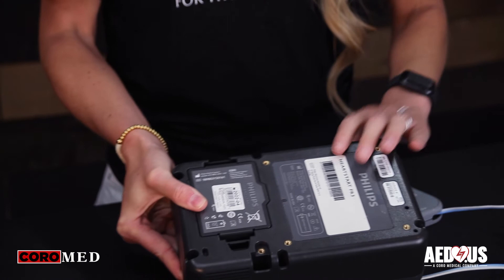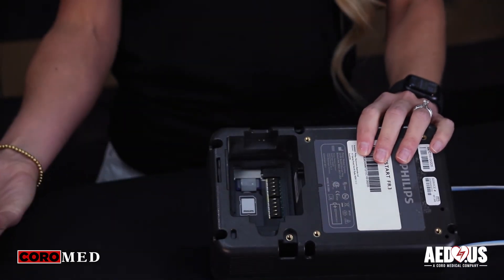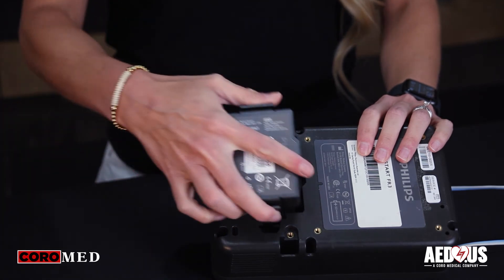The battery has a three-year warranty. The expiration date and the install by date are listed on the outside of the battery. To install or replace the battery, press the tabs on the back to remove the battery. Place the new battery in.